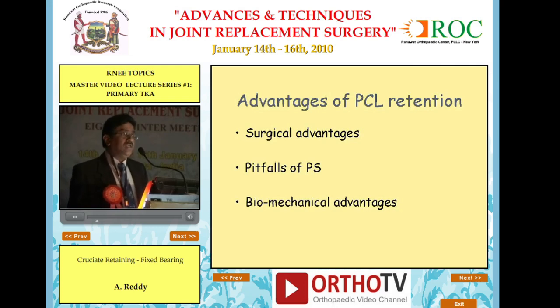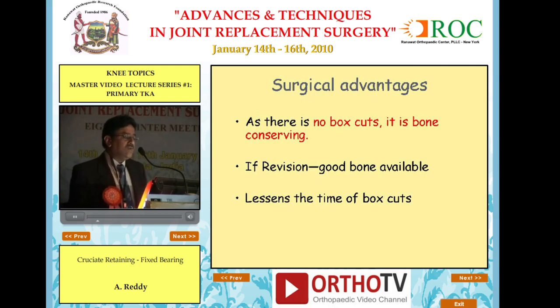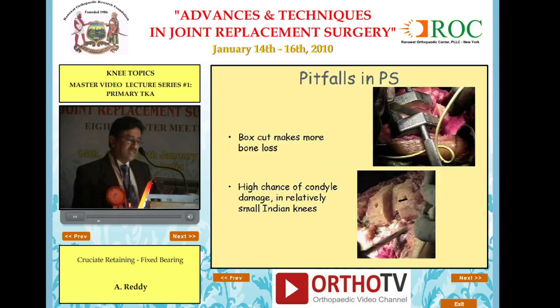The surgical advantage, pitfalls of posterior stabilizing, and biomechanical advantage. Surgical advantage is there is no box cut, so it's bone conserving. If a revision is there, good bone is available, and the time of the box cuts is less. And especially in the very small knees of India, the box cut sometimes fractures the condyle.